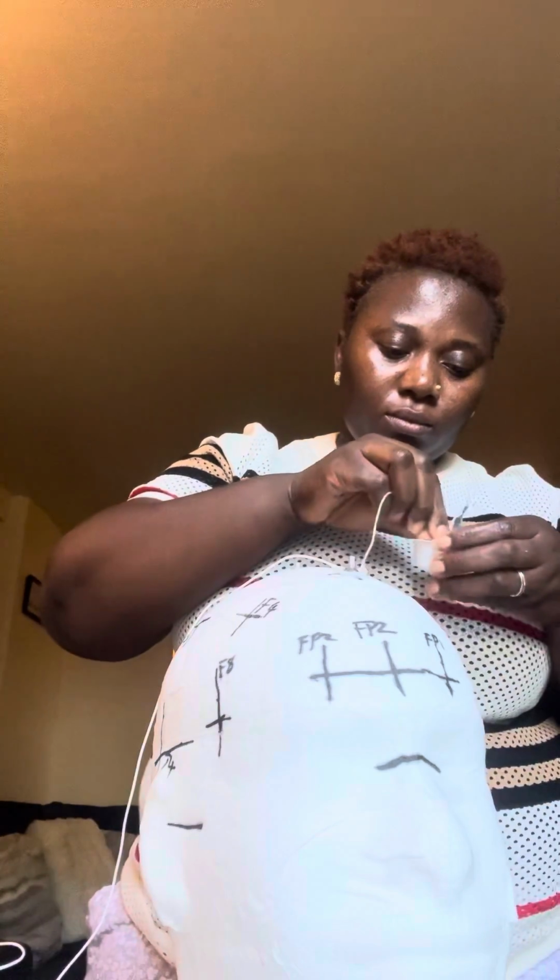And PZ, I'll still prep the skin. Okay, so this is my electrode placement, FZ, CZ, and PZ, the midline.